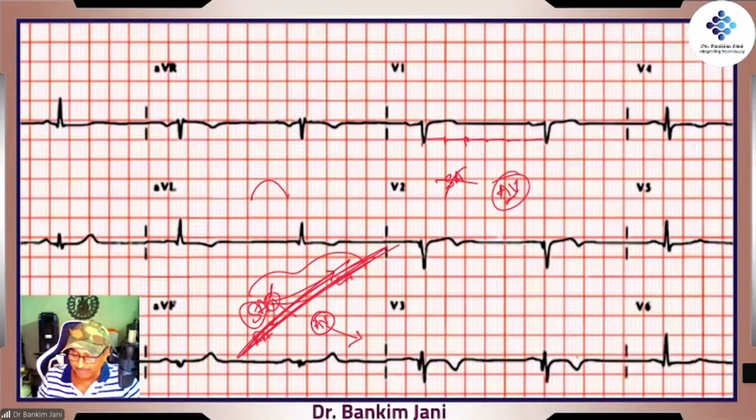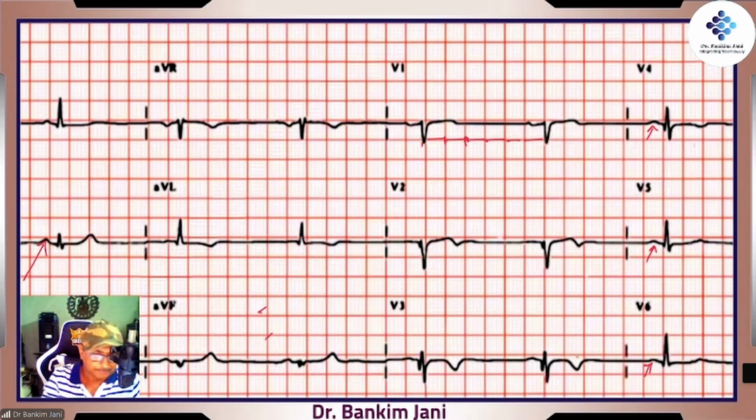And that's why we are finding that P waves, they are almost somewhere they are seen. So it is like occasionally, somewhere the P wave is seen, a very weak P wave. Right? So randomly, sometimes the SA node, see over here, there is a P wave. Right? Randomly, it suddenly wakes up and it fires. And then once again, it is not fired. We'll see that. The total SA-AV dissociation. All right.